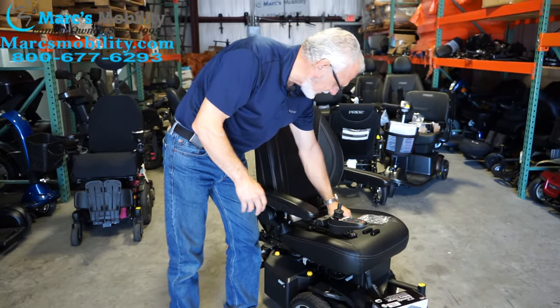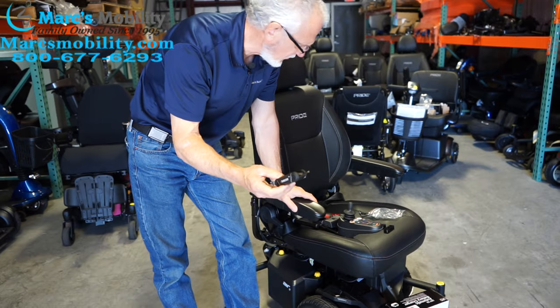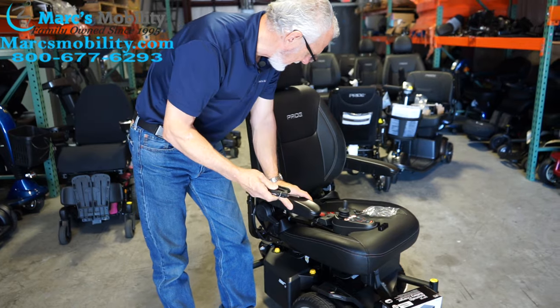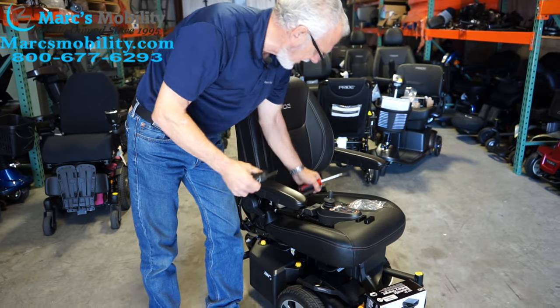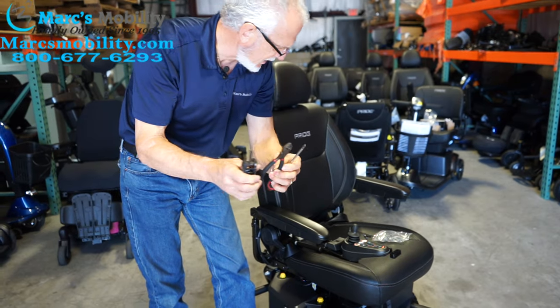To switch the joystick, you will need a metric Allen wrench, a pair of nippers, and a Phillips screwdriver. So these are the three things you'll need.